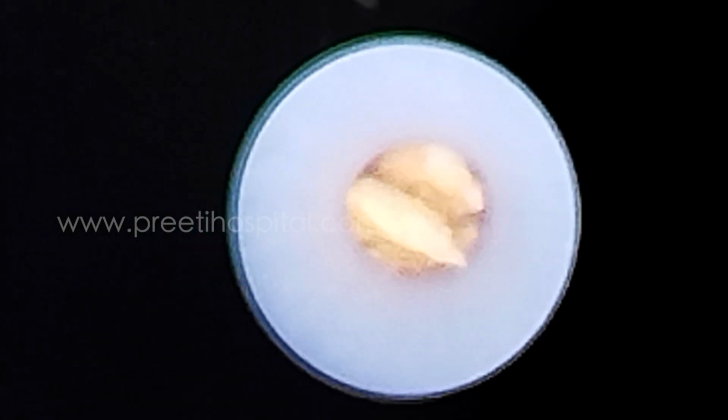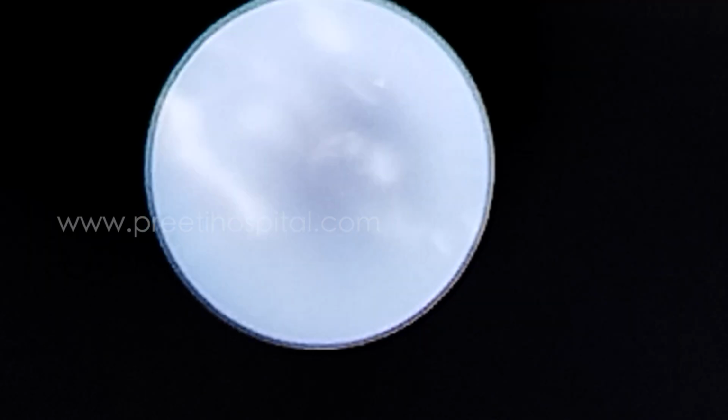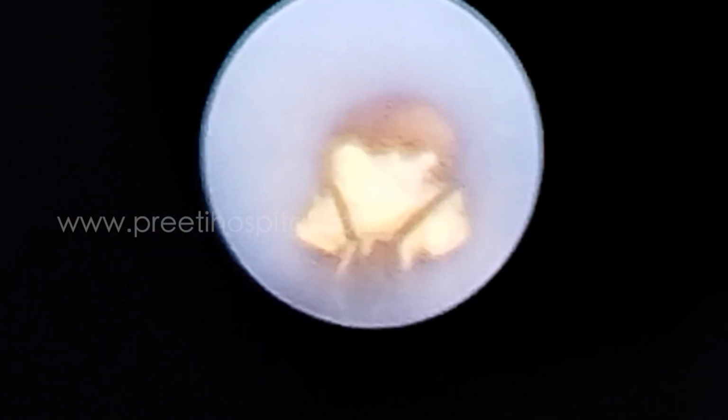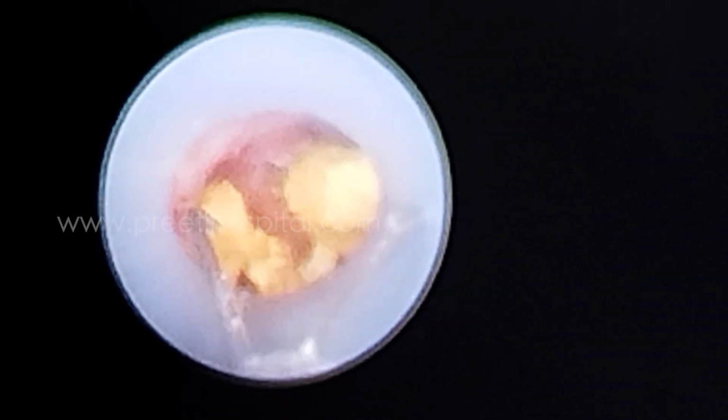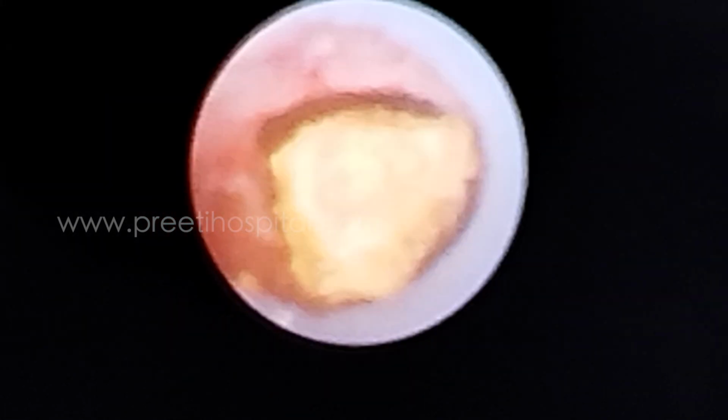Forceps. Moving piece laser. Fixed piece pneumatic. Fixed piece no problem. And very near to the pelvic wall impacted, laser is better, in the sense for breaking the stone. Very small stone also laser is better. PUJ impacted but stone not at all seen, pneumatic is better. Like that you have to choose. Both should be complementary. Pneumatic will stay. Remember. Will you do this with pneumatic or laser? Laser better. This is very important.